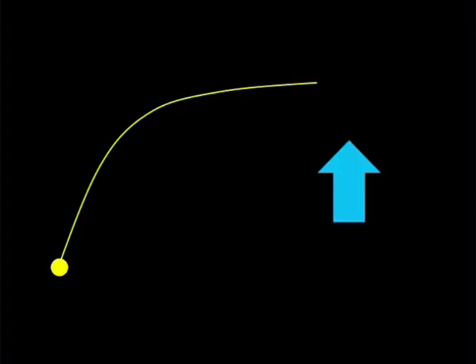So this is another way to look at T1. This is the kind of drawing that you'll often see as a T1 curve. So we start out here where we've been knocked completely down. Their net magnetization is no longer in the path of B0. We've been hit with that pulse down to 90 degrees, and then we start to recover.